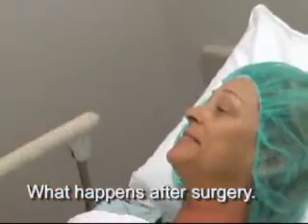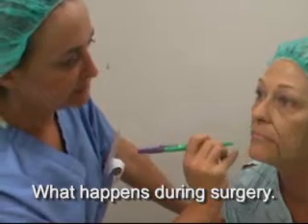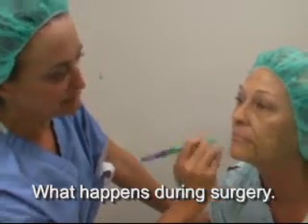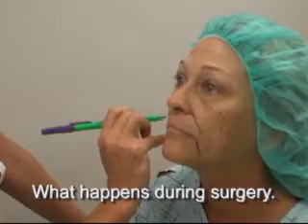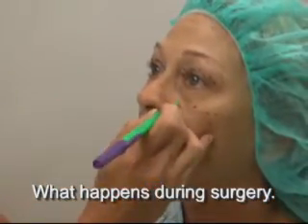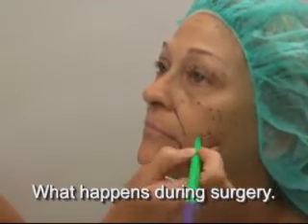Okay, so we are going to be injecting some fat into the creases on the side of your cheeks called the nasolabial folds, into the downward tilt of the mouth as well, into the round part of your cheeks that have lost their volume due to loss of fat.